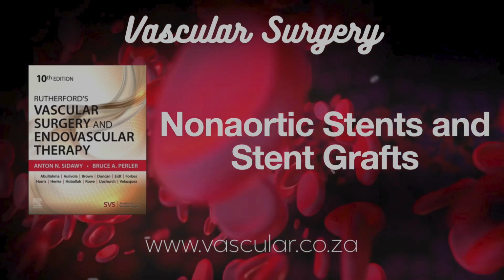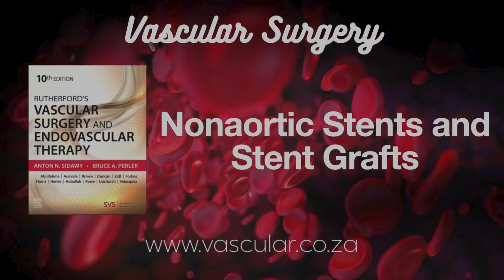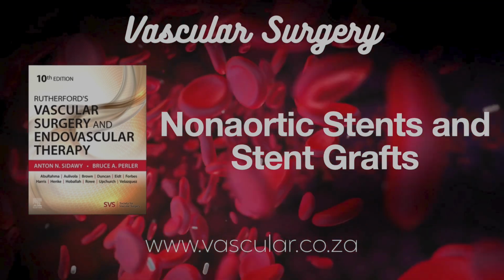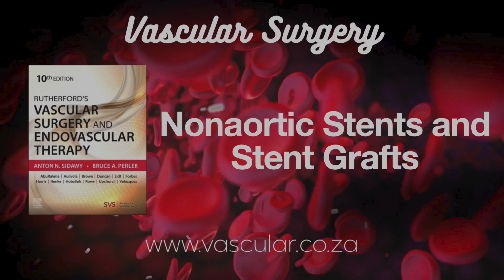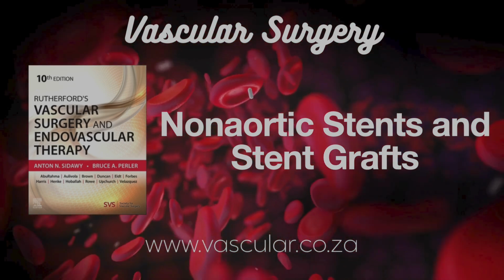And further down those arteries, away from the origin? Then SE stents might be better, especially if there's a tear or dissection. Sometimes, for smaller vessels way downstream, just balloon angioplasty without a stent might be enough.